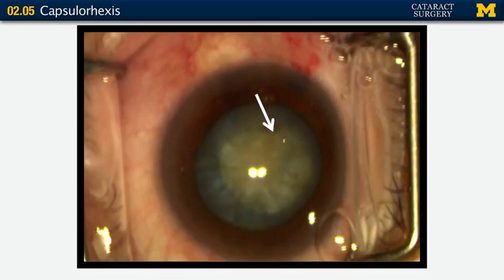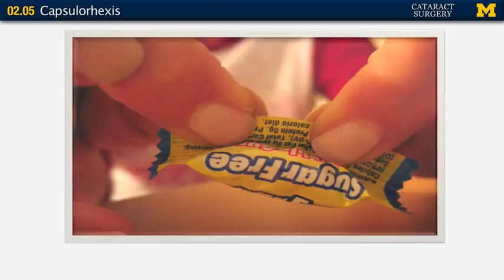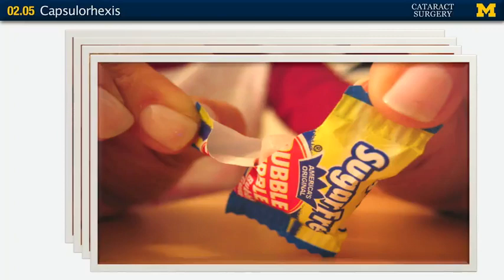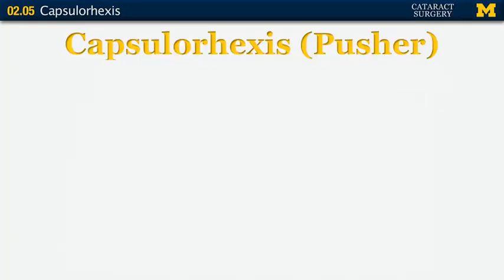This is what you don't want to have happen — that's an irregularity in the continuous curvilinear opening, and that's a prime spot for tears. That's exactly what happened in this case — a nice tear. The capsulorhexis tends to tear when there's a tag or irregularity because it behaves like cellophane. Cellophane with a smooth edge is very resistant to tears, but if there's an irregularity it tears very easily.